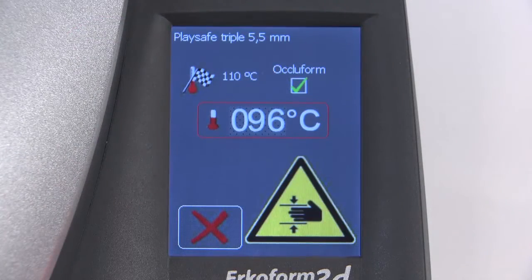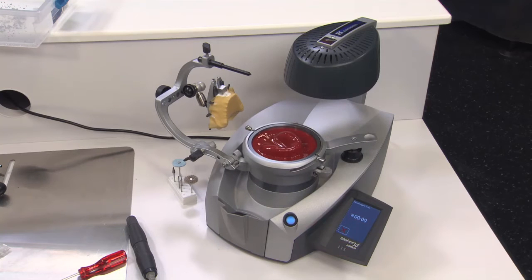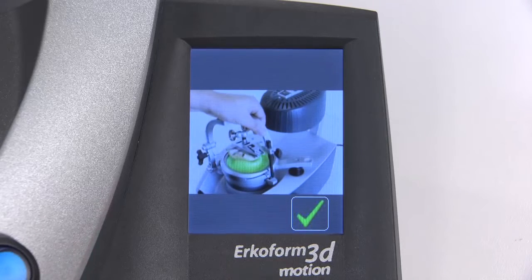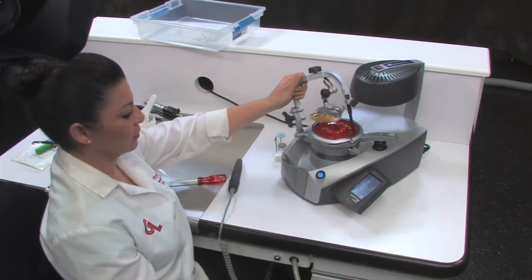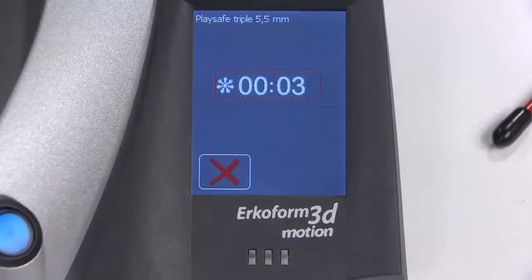Once the optimum temperature is reached, the foil holder will automatically rotate and lower onto the model. Immediately after lowering onto the model, the machine's vacuum will remove any air from the pot, allowing the foil to be thermoformed. Allow one minute of cooling time. The screen will then instruct you to use the Occliform. Close the Occliform until the supporting pin touches the base, and leave it closed for the remainder of the cooling time.